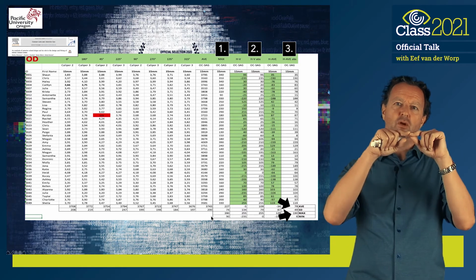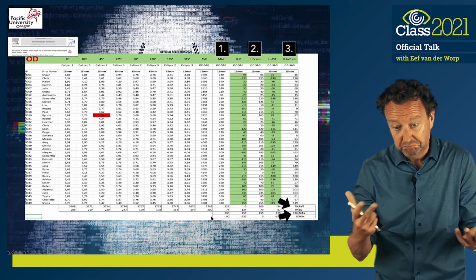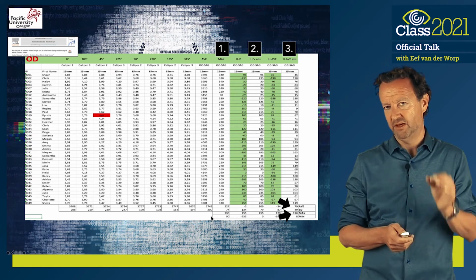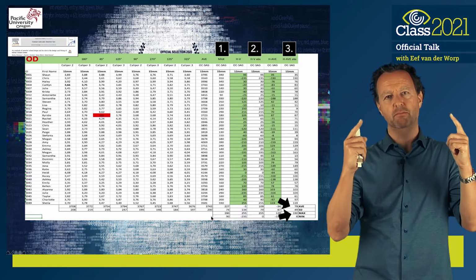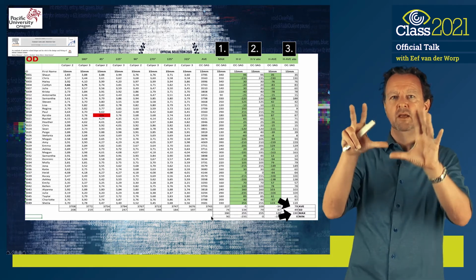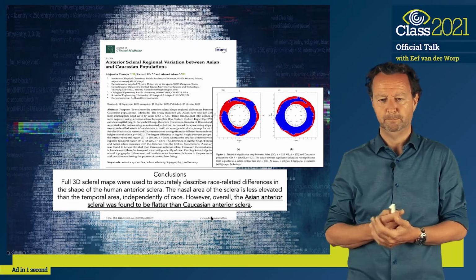If you have an instrument that can only measure the horizontal, you're a little bit off by about 80 micron on average. It could be up to 200 micron basically. So it's not perfect, but it's not the end of the world either. So it's definitely better than nothing. But one thing we have to keep in mind, and we'll use it in the second part of the presentation too, how is that lens actually going to flex on the eye in these different meridians? It's not a two-dimensional, it surely is a three-dimensional exercise.